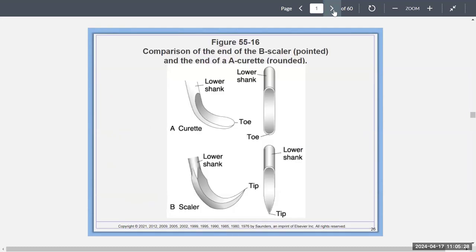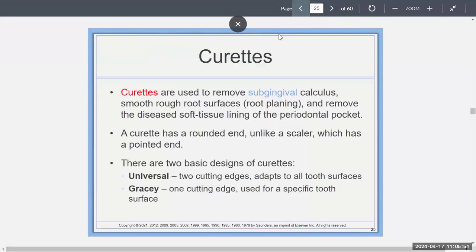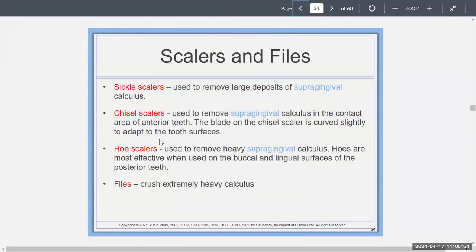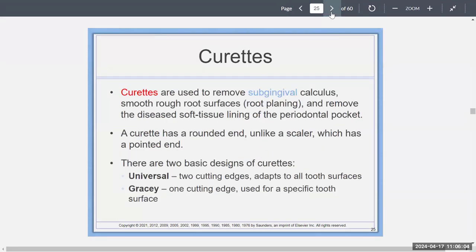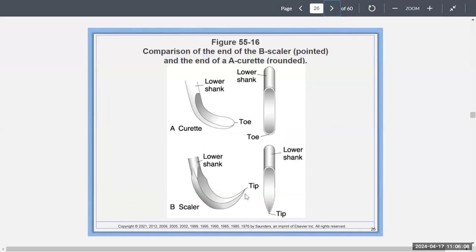This picture in your textbook shows a comparison of scalers and curettes. The scaler is pointed in letter B — more pointed — and the curette in letter A has a rounded end. Scalers are pointed because they only deal with supragingival calculus. Curettes are blunted because they go subgingival, and if you used a pointed tip subgingivally you can shred and traumatize the gums.